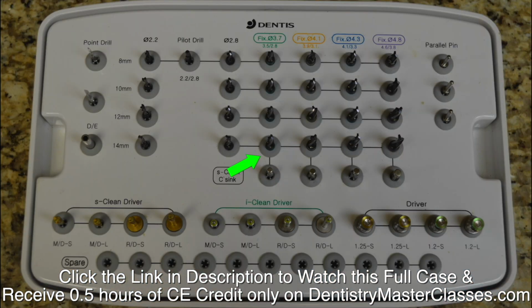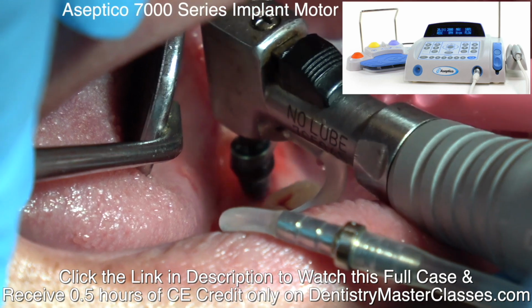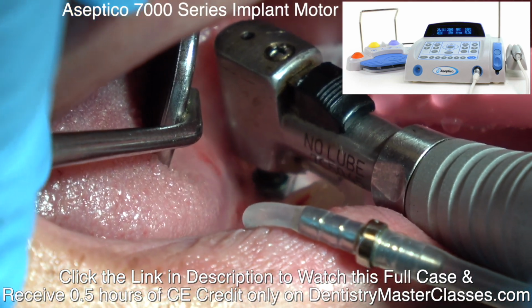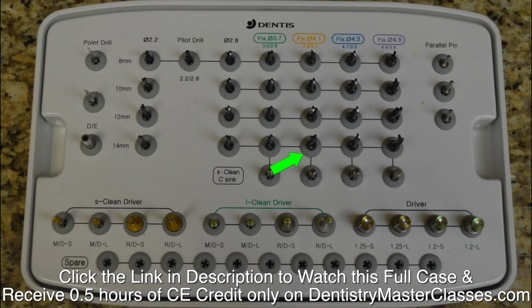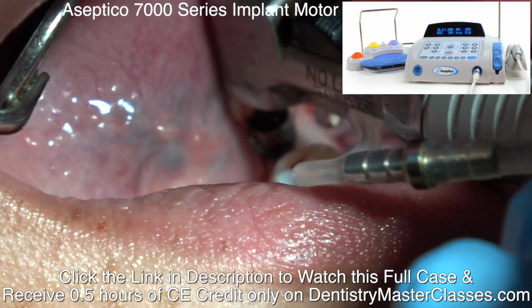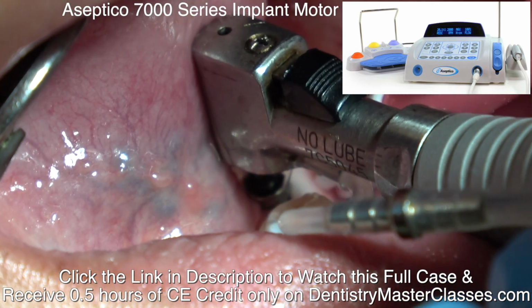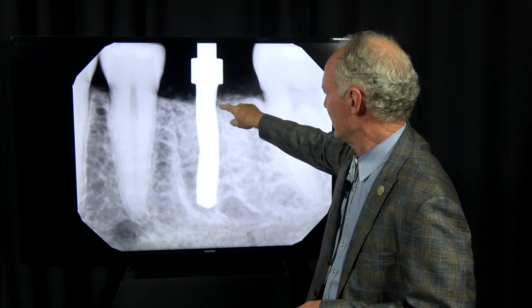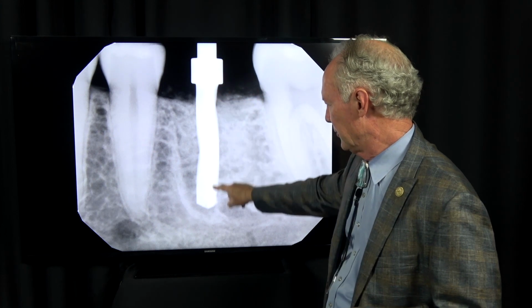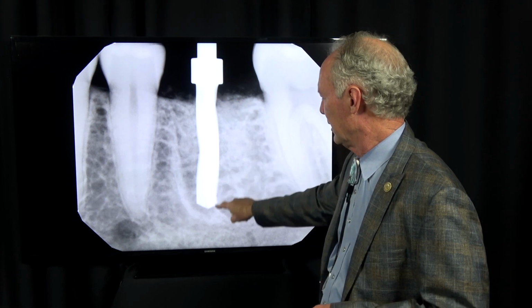Then I'm going to go to 3.7. You can see it's good and parallel. Then I'll go to 4.1. So it's very easy once you get your depth, because that shoulder is stopping on the soft tissue. So this is 2 millimeters. So if this is 14, you know you're going to have 12 millimeters in bone.